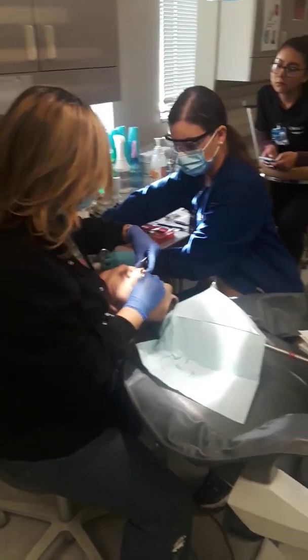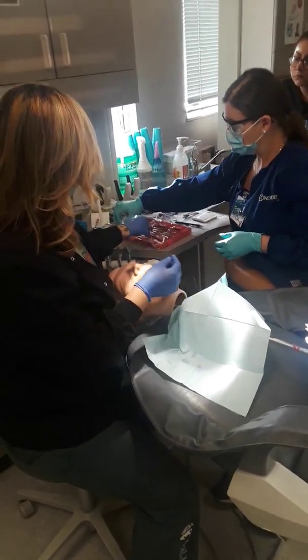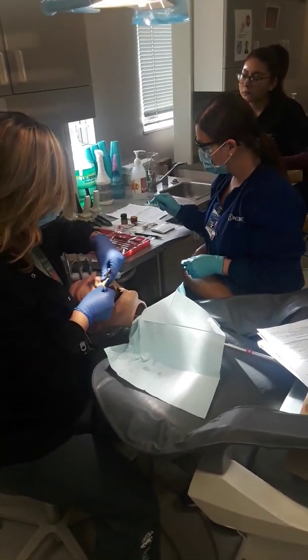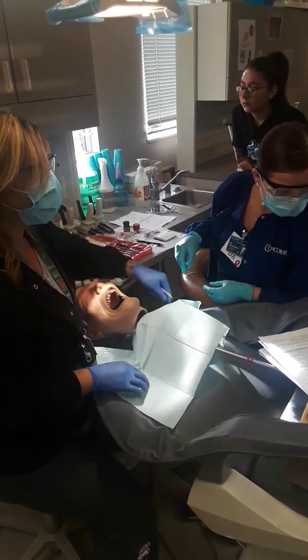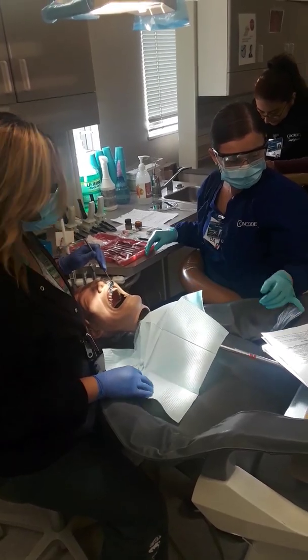Okay, now that we're done prepping, we're probably going to change this because this is soaking wet. Change the cotton roll. Then my assistant's going to get ready. She has our cord already pre-soaking in Hemodent solution, which is stopping blood. So she's going to pass me my cord.